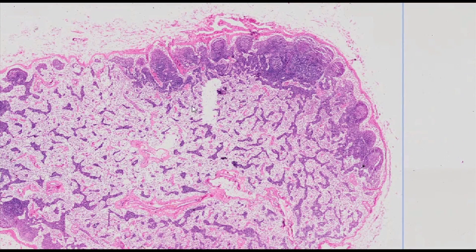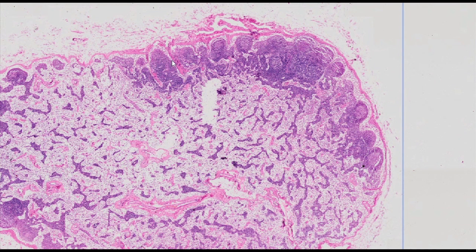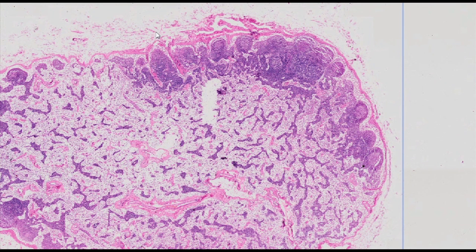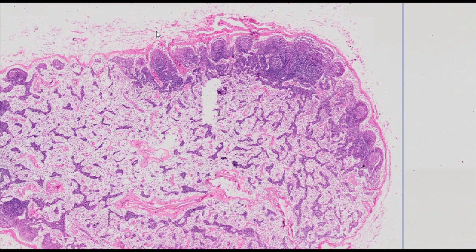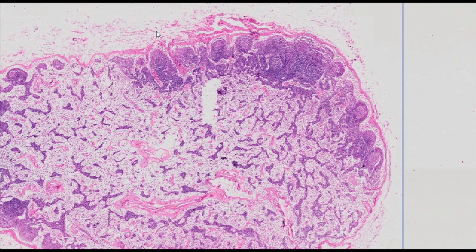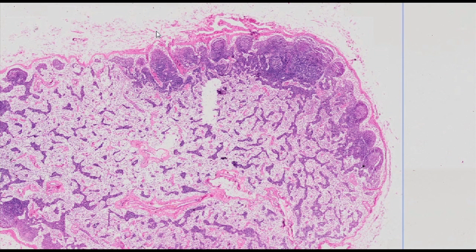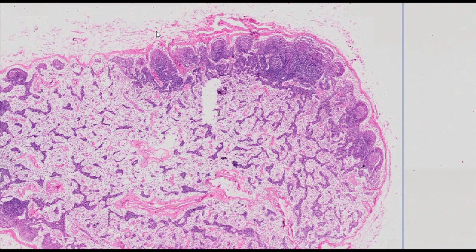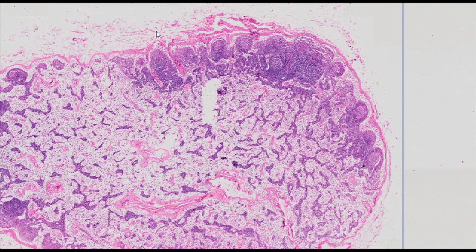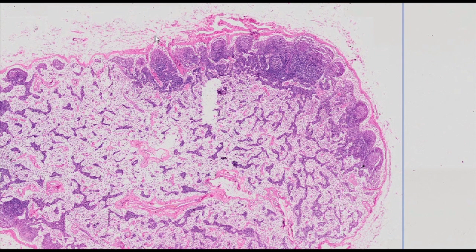In the outer regions of the organ, the trabeculae form niches. The nodal stroma is composed of reticular connective tissue. The analyzed specimen has been stained with H&E; therefore, the identification of cells and fibers of the reticular connective tissue is not possible. This tissue can be visualized with the silver method, as connective tissue fibers are referred to as silver absorbent.